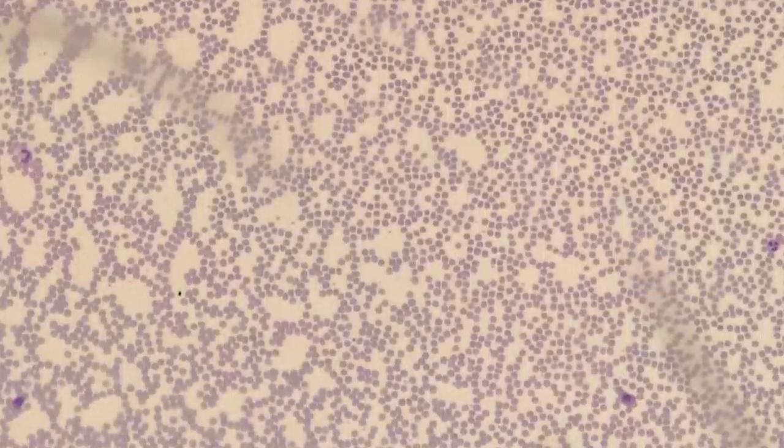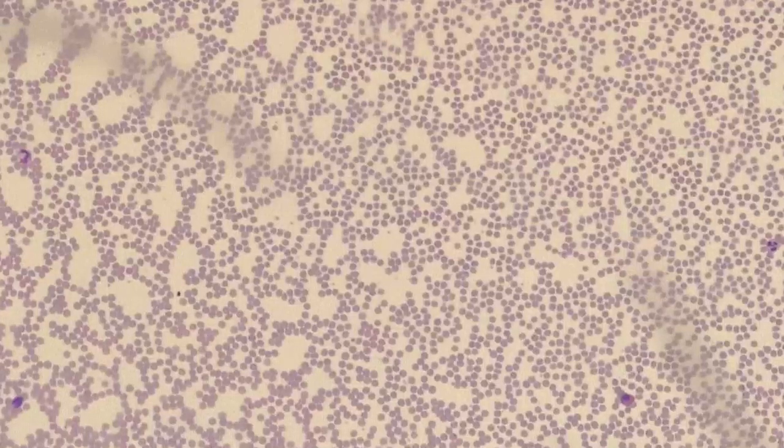We're at the edge of the slide, and some people like to refer to this as blast alley. I always take a quick look here, because once again, larger cells, meaning white cells, and specifically larger precursors like blasts, may get pushed out to this area. So it's always good to do a quick run just to see if you can pick anything up. Okay, I'm not seeing anything.